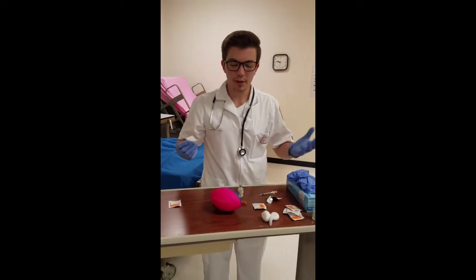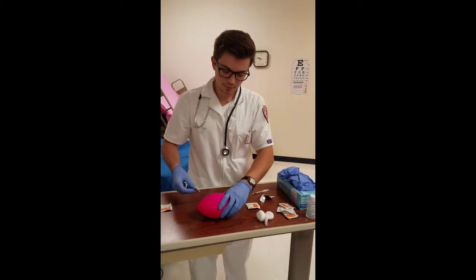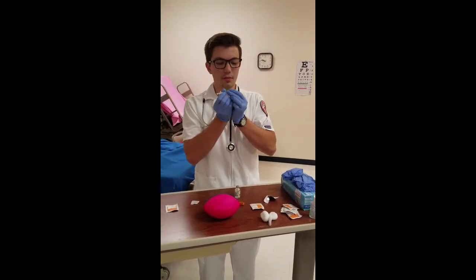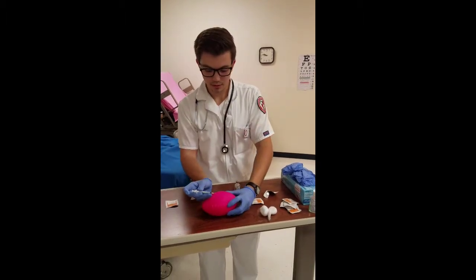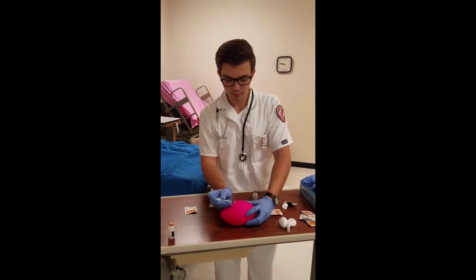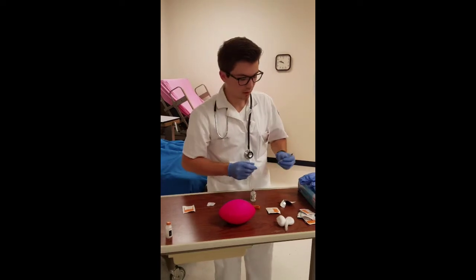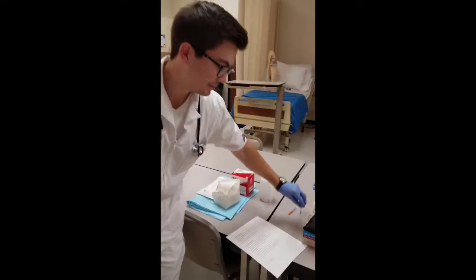But when you go ahead and give it, you're going to want to disinfect, and then you're going to take your insulin, bevel up, and administer at a 45-degree angle into the subcutaneous tissue. Inject and pull it out. Alright, and then you would put the sharps in the sharps container.